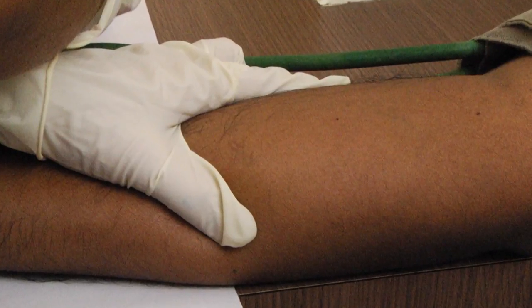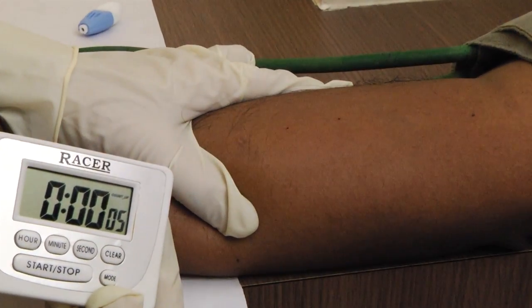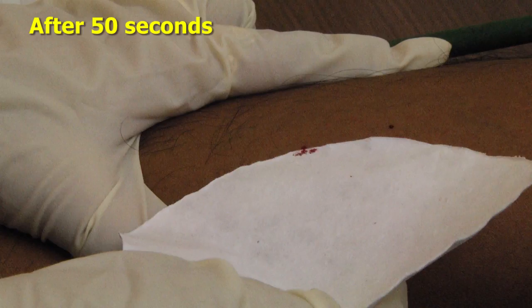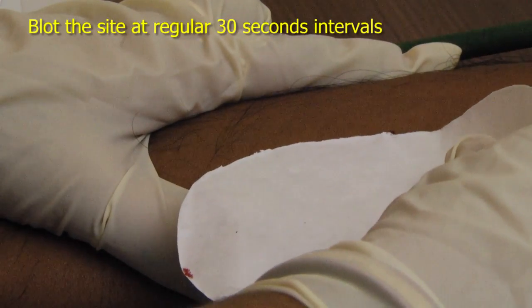The punctures must be performed within 30-60 seconds of inflation of the blood pressure cuff. Simultaneously, start the stopwatch. Do not wipe the blood. After 50 seconds have passed, blot the blood with the filter paper. The filter paper must not touch the wound on the arm.